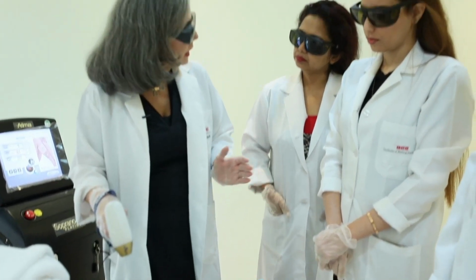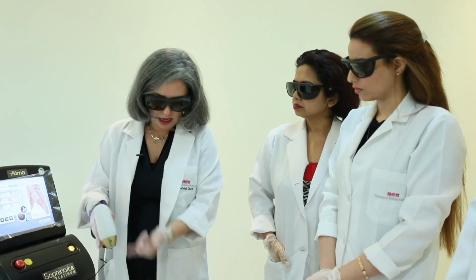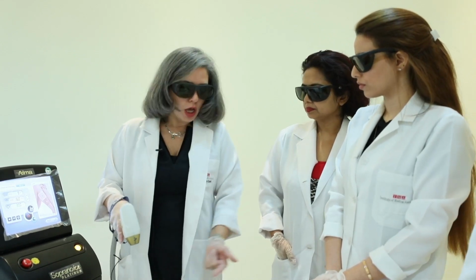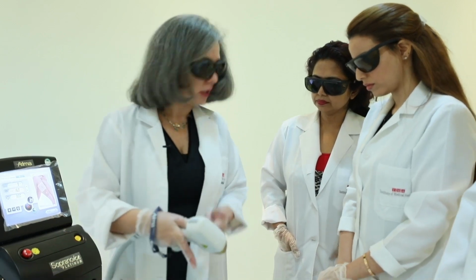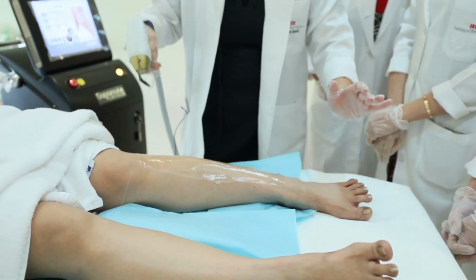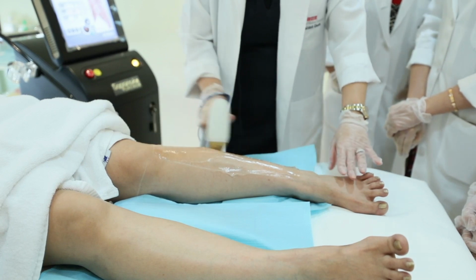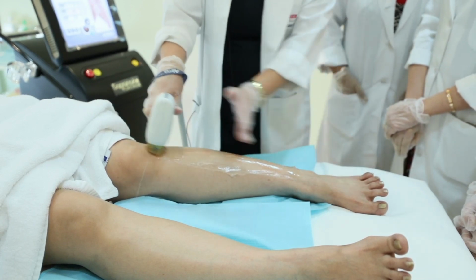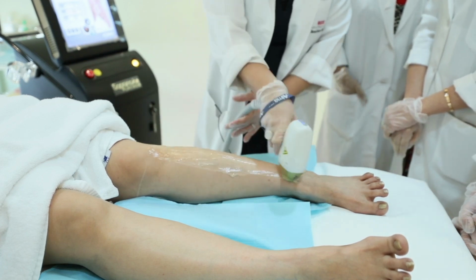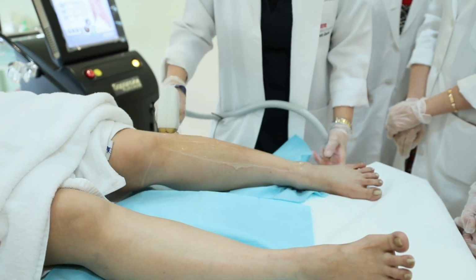So I'm going to be in motion. I can press only some of the lasers, they have 2 triggers. Now I have 2 triggers for the laser to be shooting. So you can press your foot pedal, but not the finger. I want you to be comfortable with the movement. If I have this much grid, I will place my handpiece in full contact, slight pressure. I start moving. If the area you feel is too long, you can divide it into 2 squares, and I want to cover everywhere. If you feel the handpiece is heavy, hold the weight of the handpiece with the other hand. Are you ready?